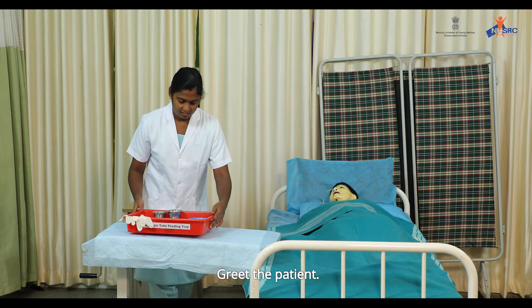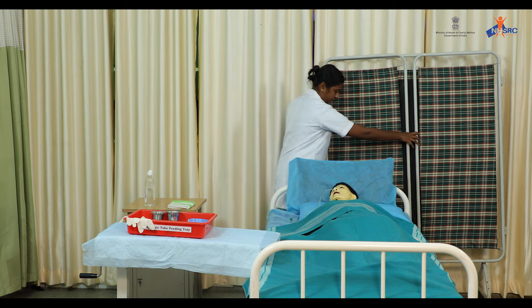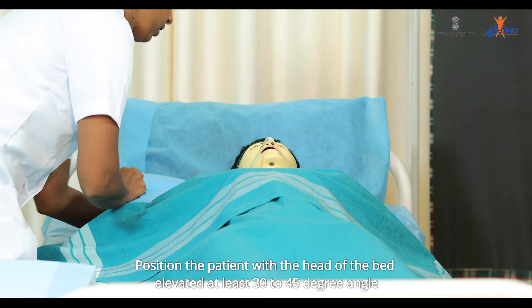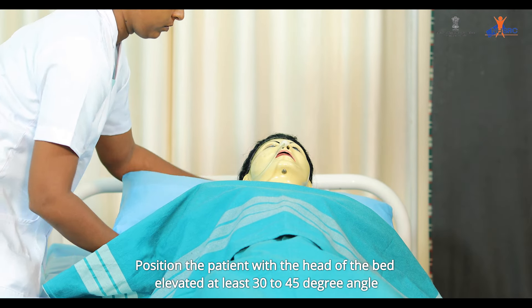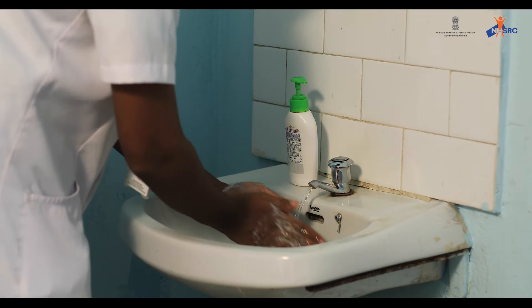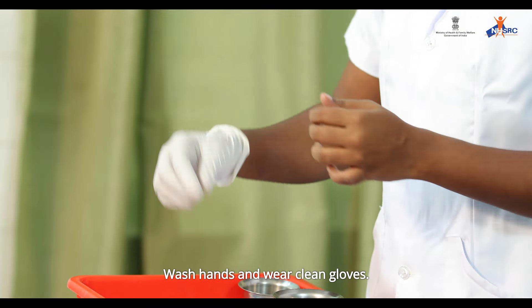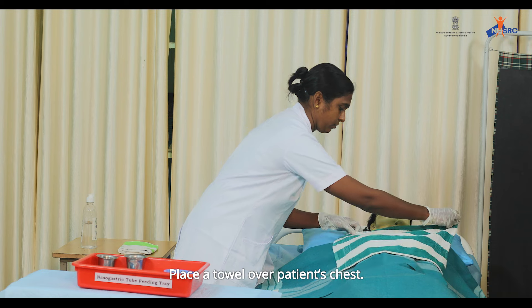Greet the patient, explain the procedure, and take consent. Provide privacy. Position the patient with the head of the bed elevated at least 30 to 45 degrees, or raise the chest with extra pillows. Wash hands and wear clean gloves. Place a towel over the patient's chest.